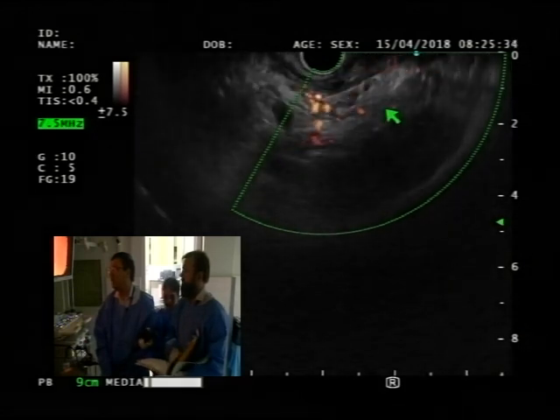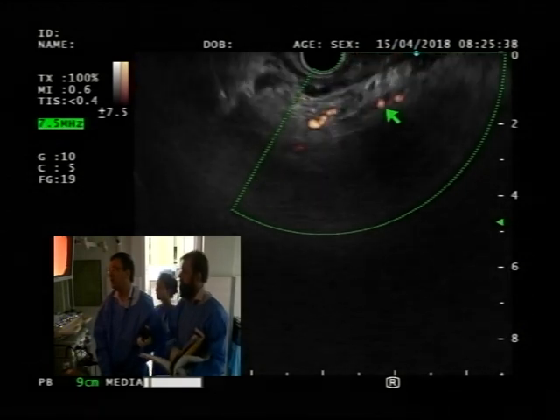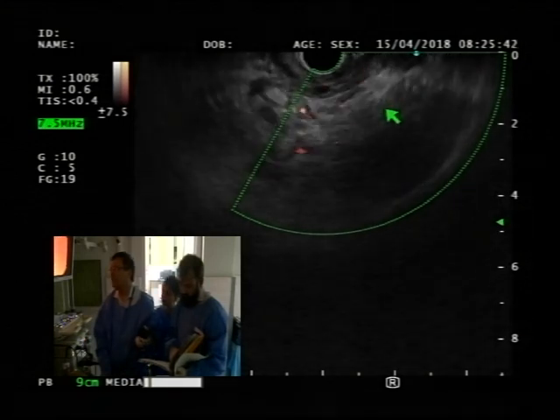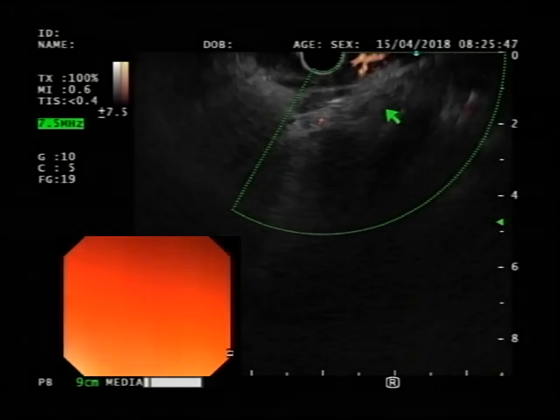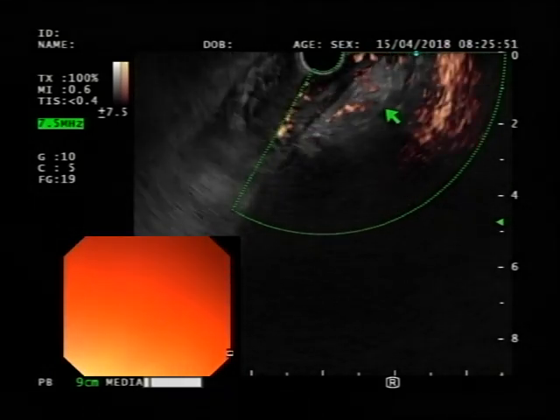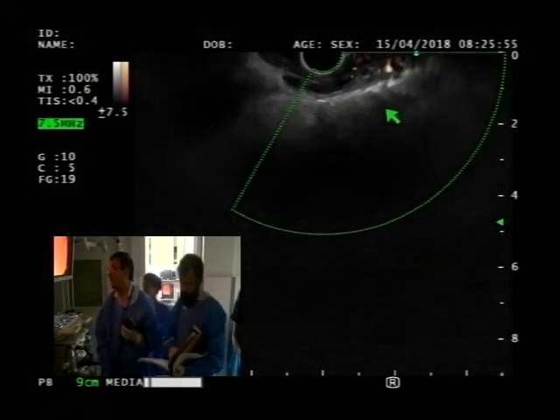Yeah. So here you see a lot of varices too. You can see a lot of collaterals there, right? And that confirms that it likely is a clot. So this is a very long process that must have taken place with multiple episodes, possibly, and we don't really see pancreatic tissue anywhere major. It's like complete atrophy.